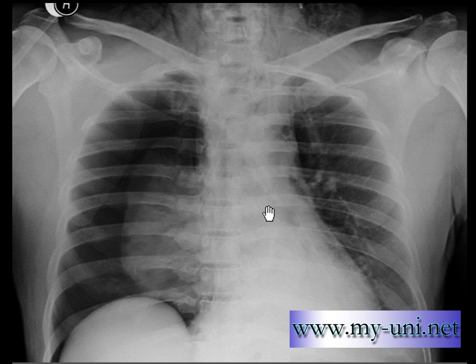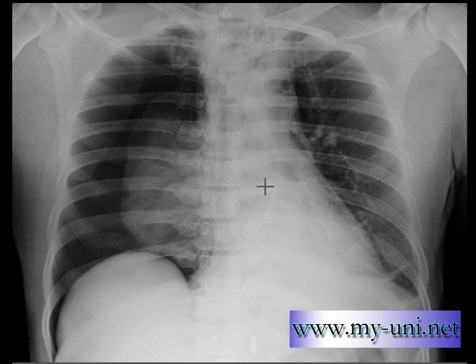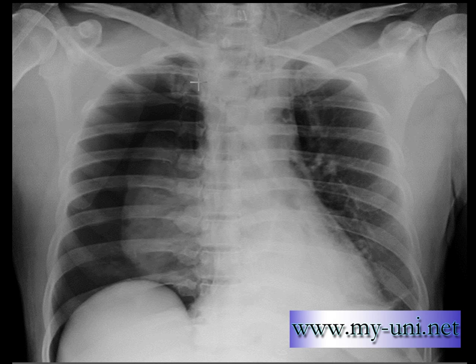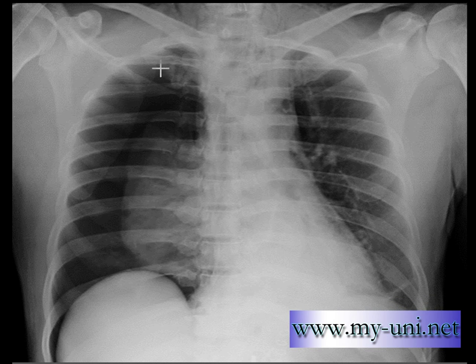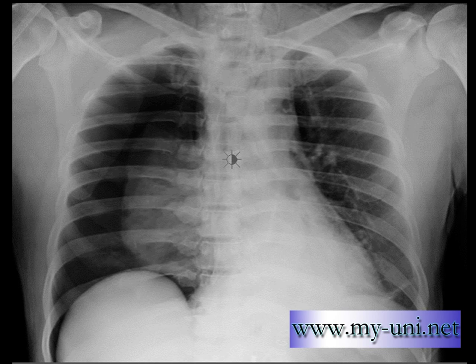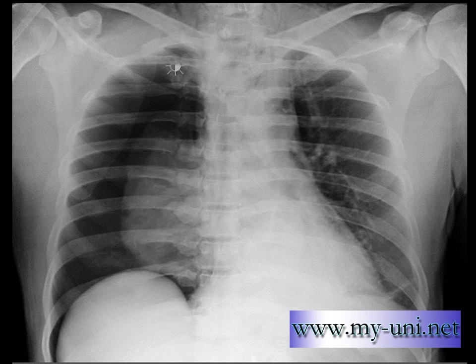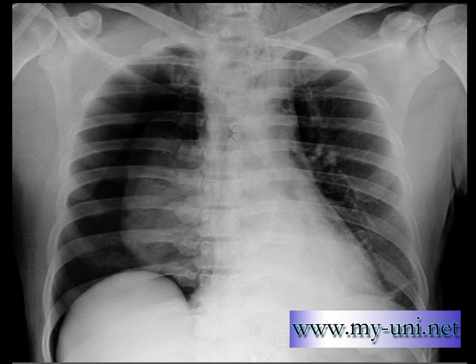A few other things to consider with pneumothorax when you have no history available — as we don't for this patient — also look for signs of trauma. Look for rib fractures, because one of the main causes of pneumothorax can be a traumatic injury. In this case I cannot see any rib fractures.